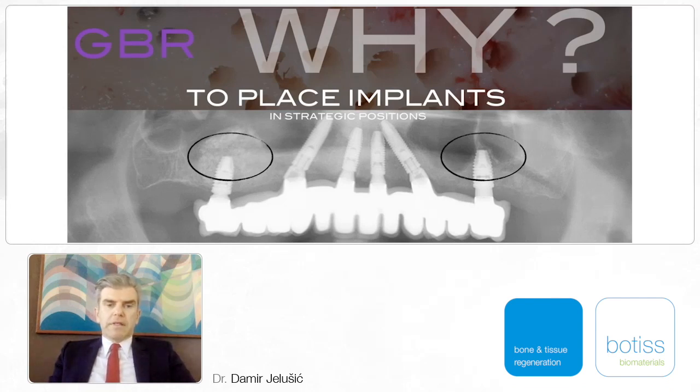But as the implants are quite mesially positioned, at the position of the canines, due to the anatomy of the patient, on the left-hand side there is a sinus lift, the classical lateral window approach, and on the right-hand side the implant is positioned in a septum with a transalveolar approach, just to make our life easier and reduce the trauma for the patient, but always keeping in mind the predictability of treatment and the end result.